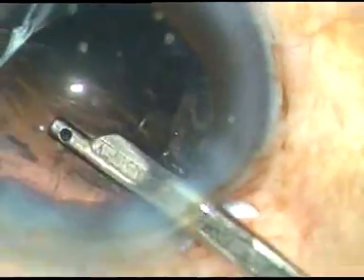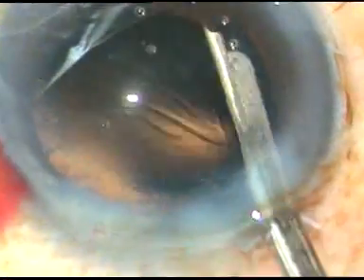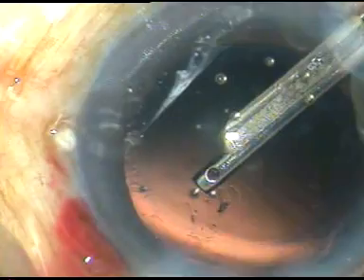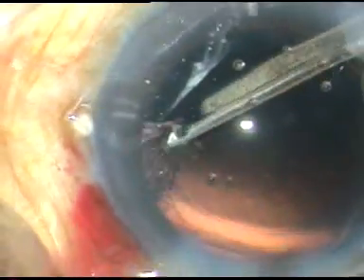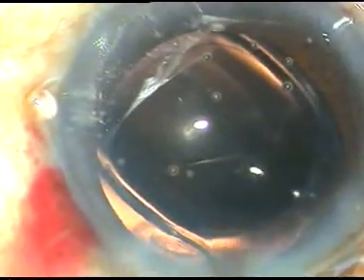Cortical cleanup is now being done. You can use whatever you like — a coaxial I/A, bimanual I/A, or this very simple thing, a Simcoe cannula. Cortical cleanup is done nicely, and we can see that the posterior capsule is clean with no cells sticking to it. Now a hydrophilic acrylic intraocular lens is implanted in the capsular bag. The irrigating probe keeps the anterior chamber formed and pushes the trailing haptic into the capsular bag.